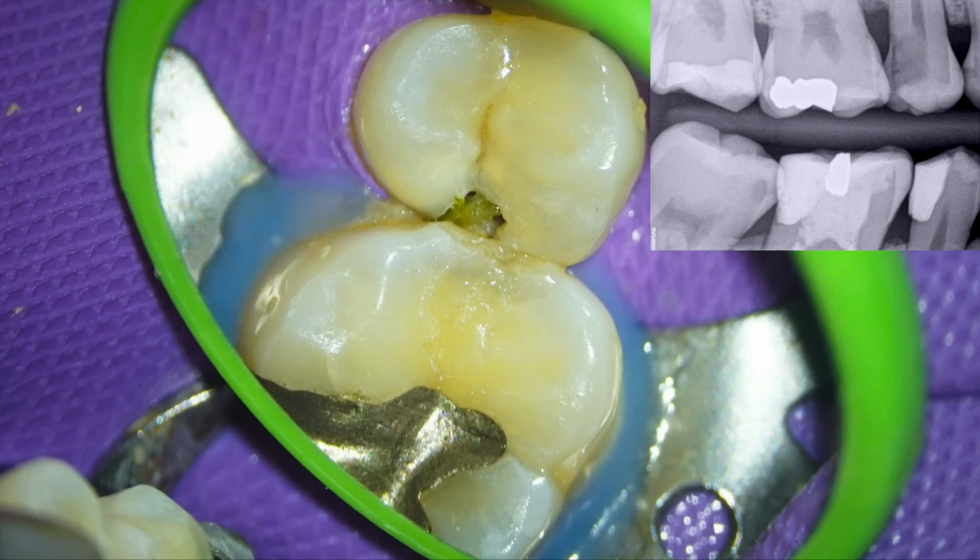Just for showing you how big the damage that food impaction can provoke in the gingival tissues can be, I will show you this case. As you can see, we have an interproximal caries here. Clinically, it does not look so big, but in the radiograph, you can see there is a big caries. So we decided to remove the caries.